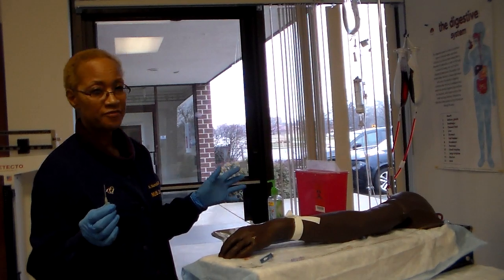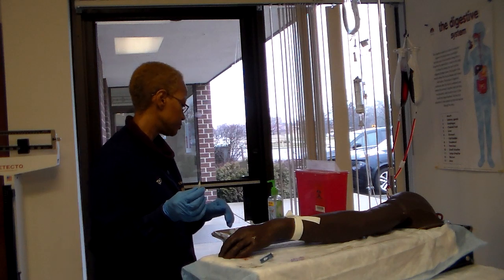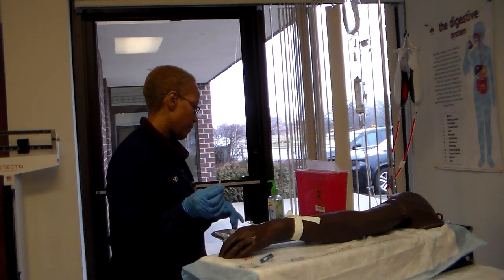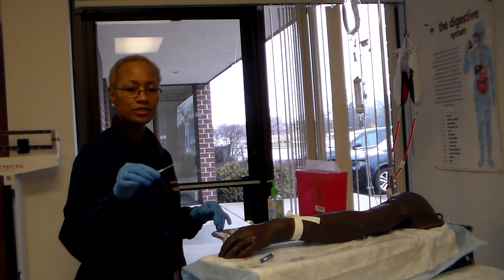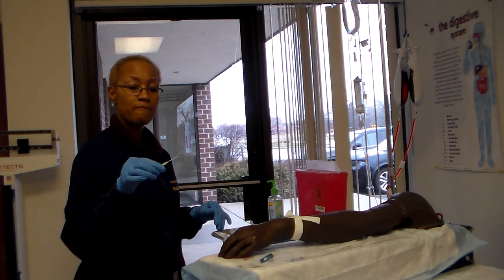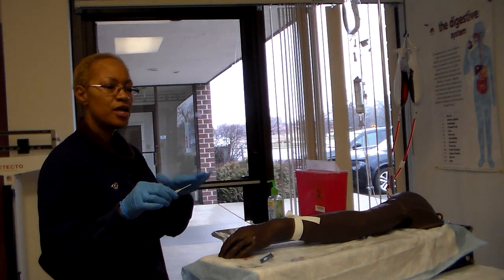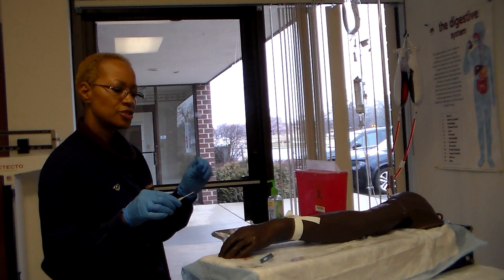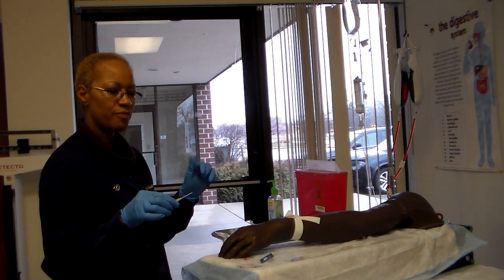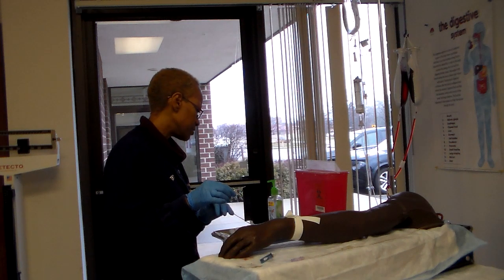And you're never supposed to fan your site. You're actually supposed to wait for it to air dry on its own. And this is just like with your IM injection. You're always going to insert the needle bevel up. Remember, we talked about how that bevel has been formed so that it's sharp. It's sharp, just like a scalpel, so that it slides and glides easily into the skin.